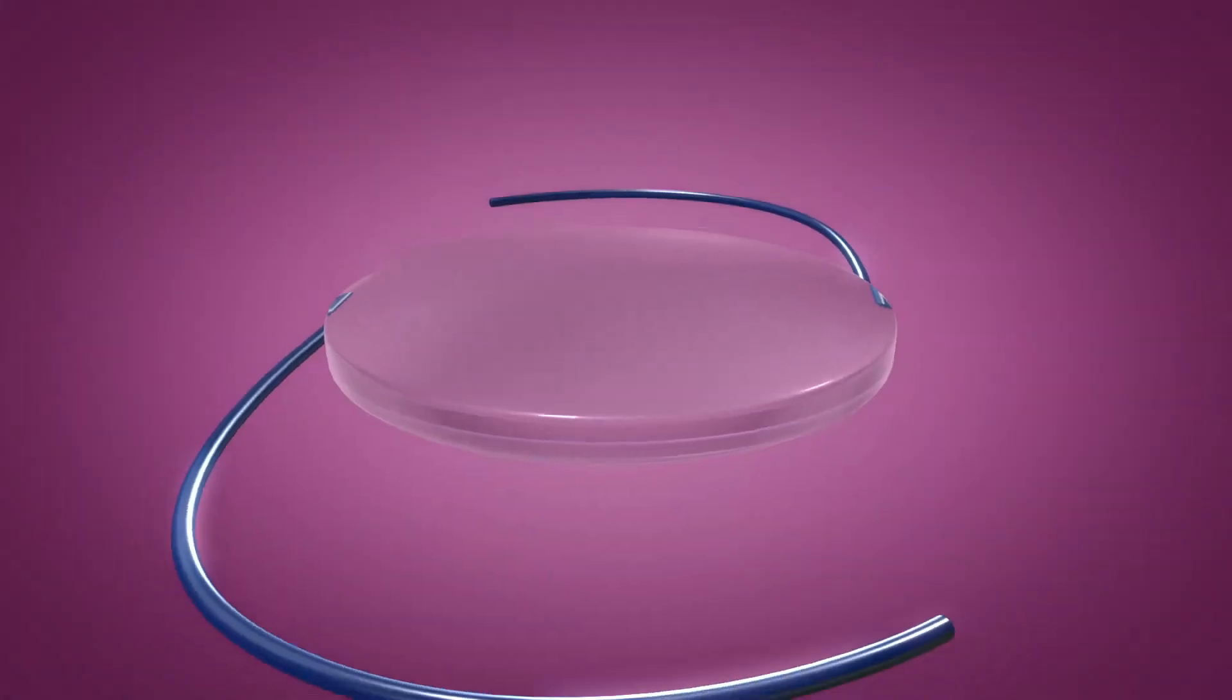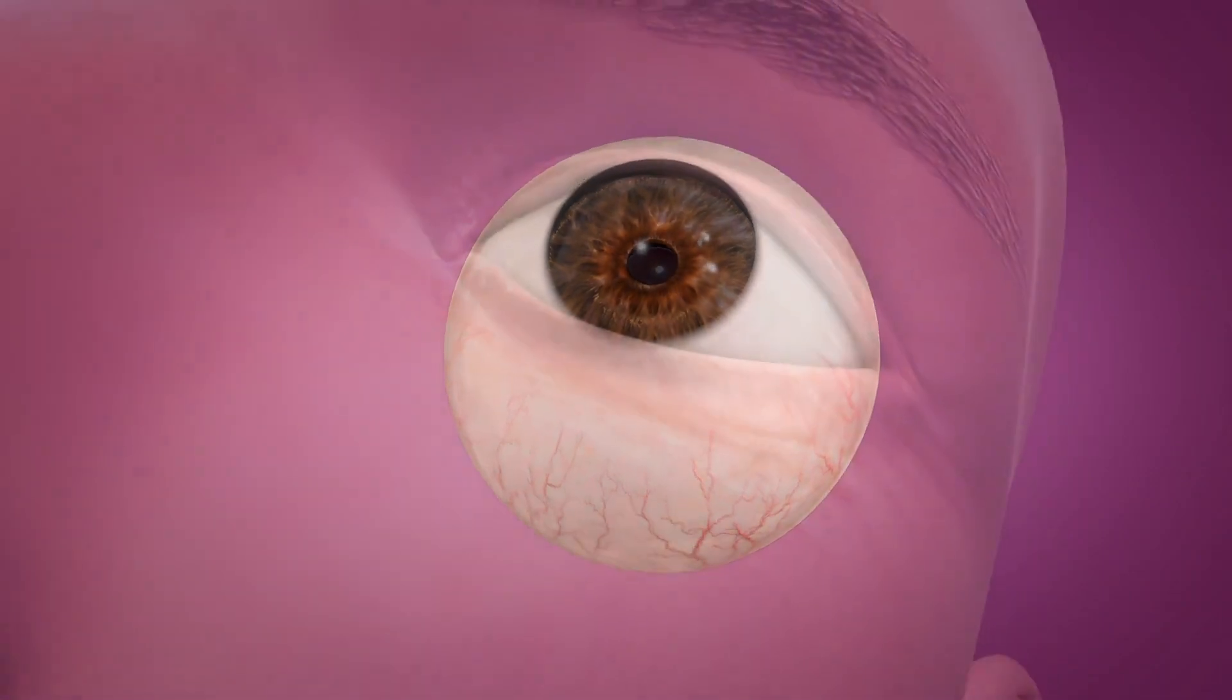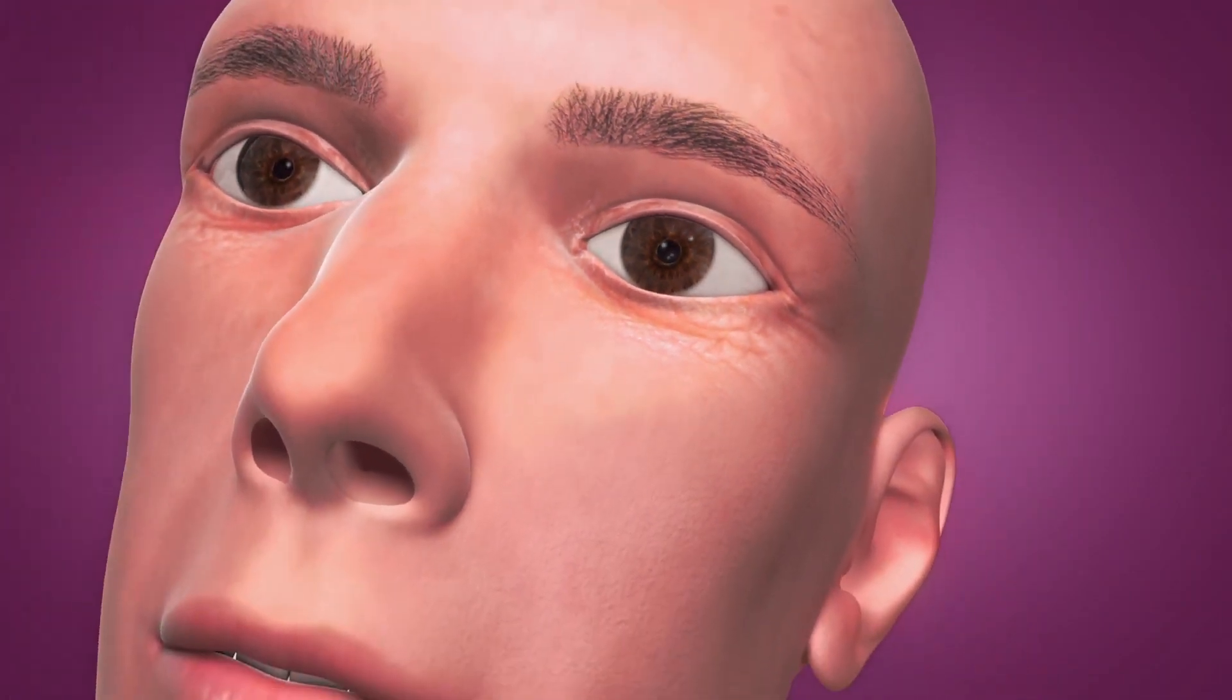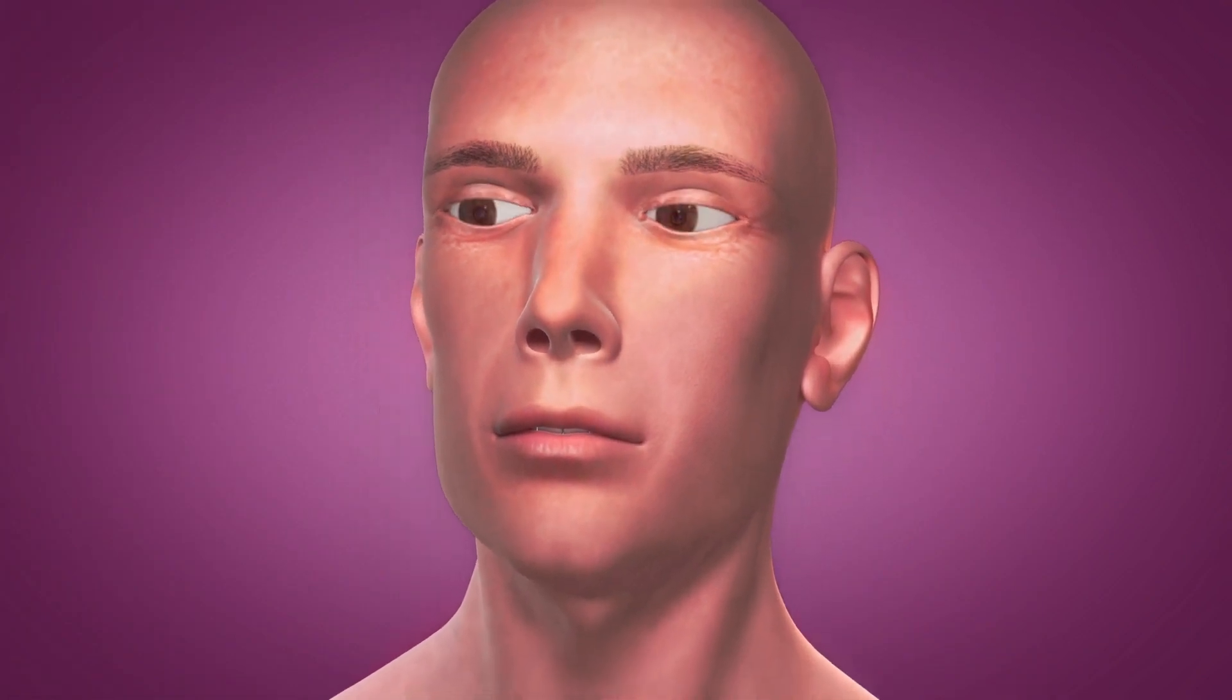RxCite's Light Adjustable Lens enables cataract surgeons to precisely reshape the lens based on the exact amount of visual correction and optimization needed to achieve the desired vision after cataract surgery.